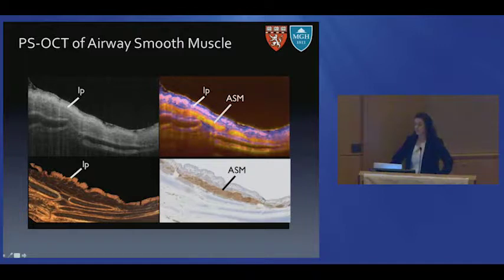And you can see that that nicely provides additional contrast here to pull out or highlight organized tissue. Now, it's also going to highlight collagen, which is why you see a lot of birefringent tissue here. So we have a picrosirius red stained histology slide here highlighting all the collagen, and an alpha smooth muscle actin stain histology slide here highlighting the smooth muscle.